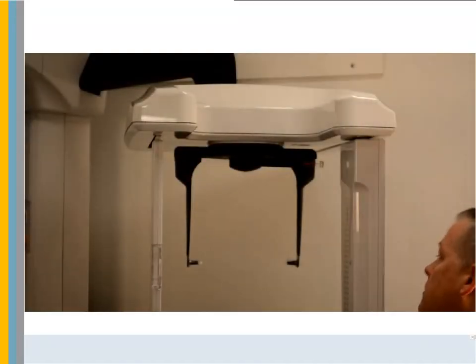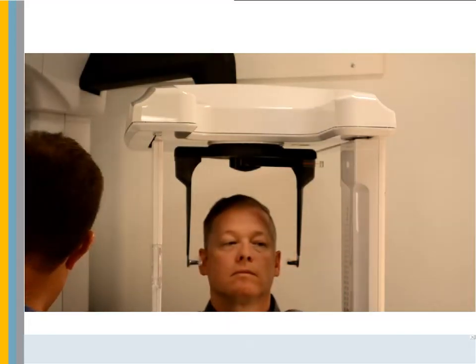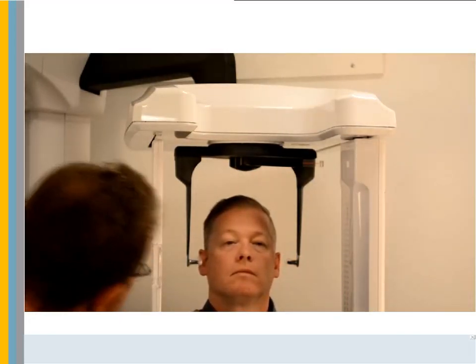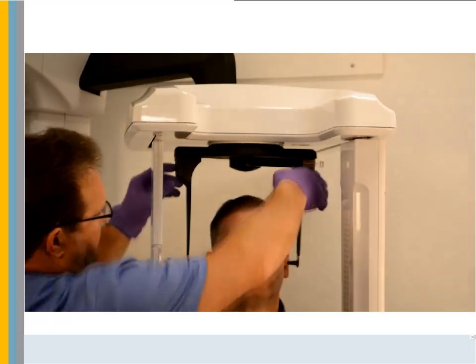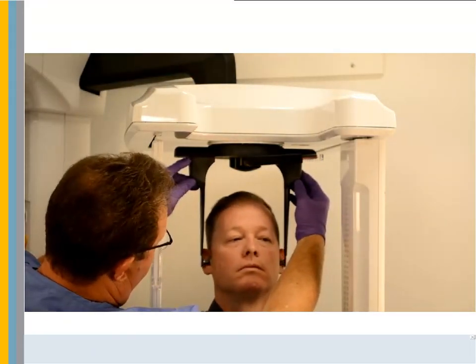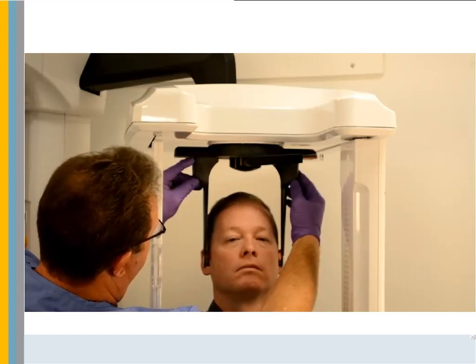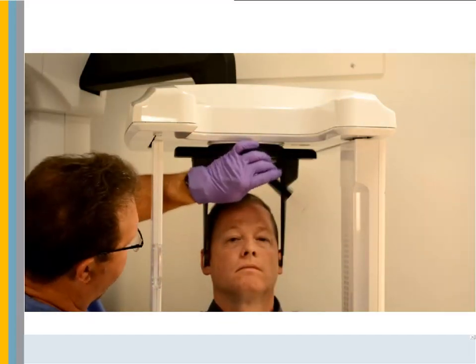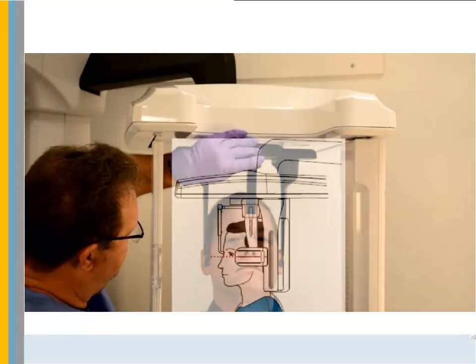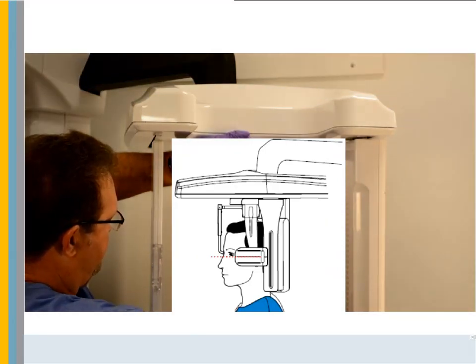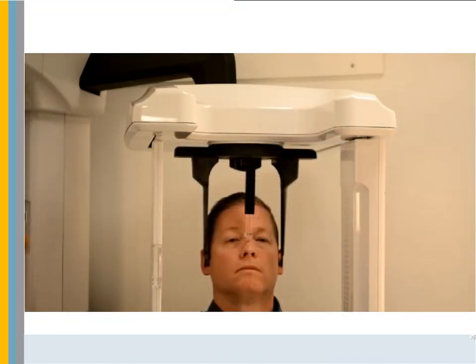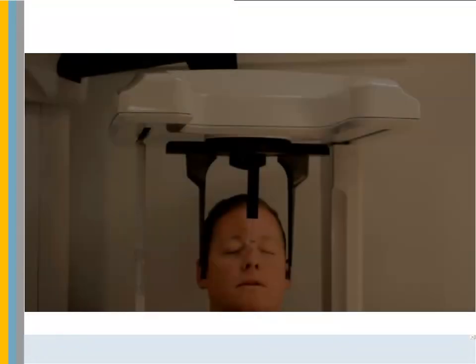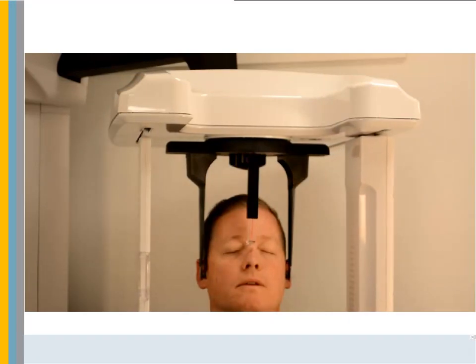Make sure the head clamp bar is fully open and covered with an ear cone sheath. Do not pull from the bottom of the head clamp. After the unit is at the correct height, ask the patient to enter the unit and slowly close the head clamps. Then lower the Nasion bar and align it. Align the patient's head on the Frankfurt plane. Take the scan.